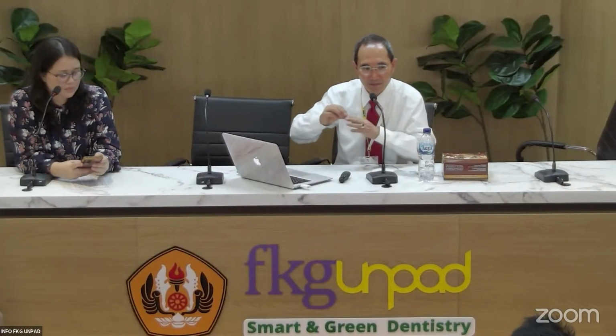Okay. So, Professor Yang, actually CBCT is more advantageous to detect lesions in the bones, not in the tissue. Yes. The reason the radiation dose is less than medical CT is because we use this cone-shaped beam. We actually reduce the radiation significantly for the patients. But for medical CT, they do need to see the soft tissue, so they use the fan beam. It's a very narrow beam, layer by layer, so they have higher resolution. They can see the soft tissue.